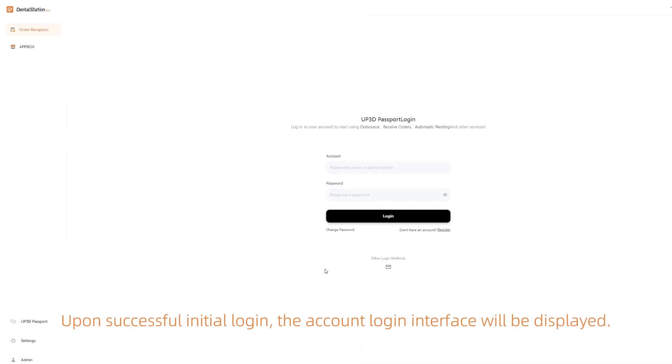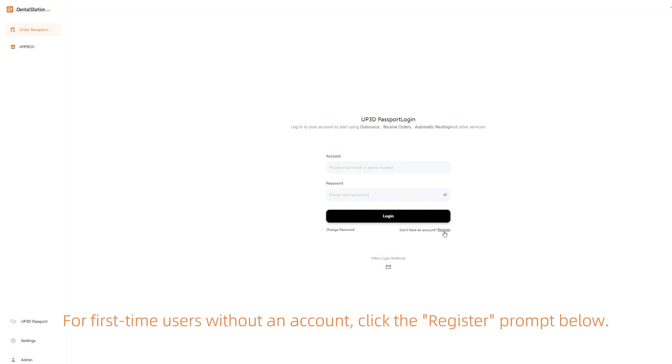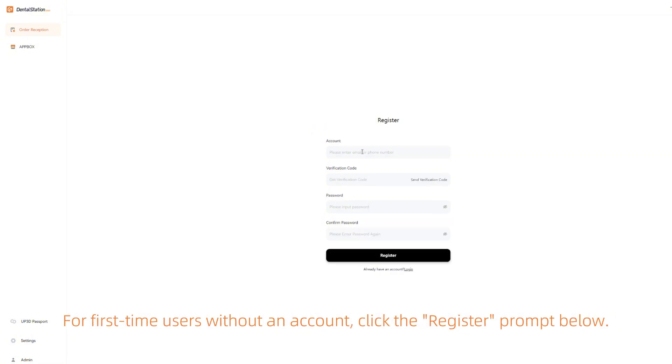Upon successful initial login, the account login interface will be displayed. For first-time users without an account, click the Register prompt below.